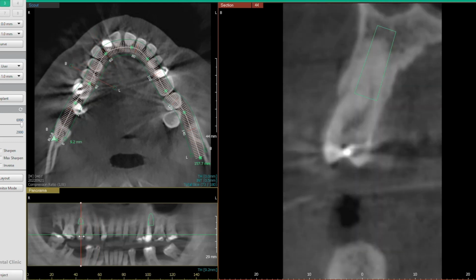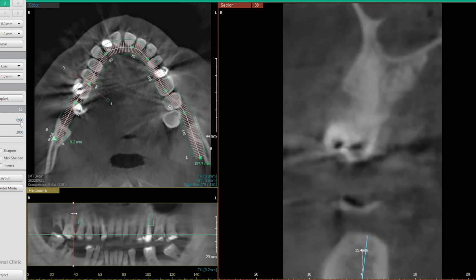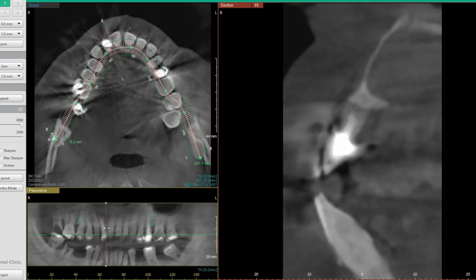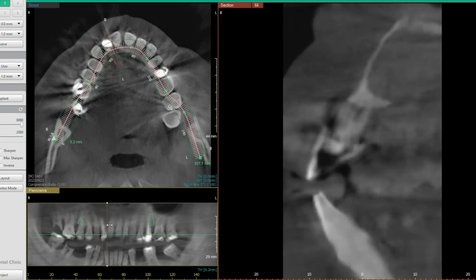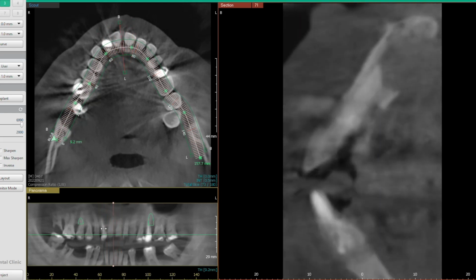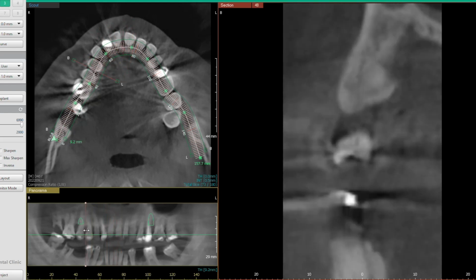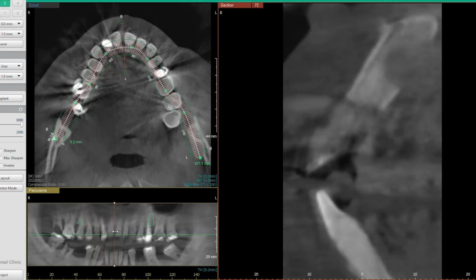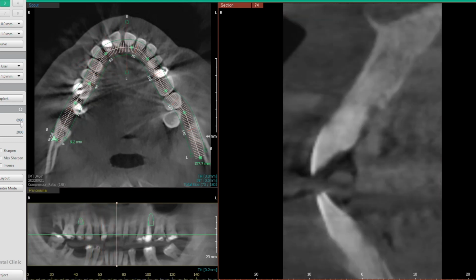So what we actually did was we placed 7 implants. We placed 2 pterygoids and placed, honestly, I don't even remember. I have them in my notes here, but we placed 7 implants on him, and we had to basically avoid this whole area because it was so infected. So we placed an implant right over here, and then we placed another implant right over here. Is that spread a little bit more than we'd like? Yes, but with the advancements in materials today, we're going to be fine. But still, definitely, ideally, not what we want to see.